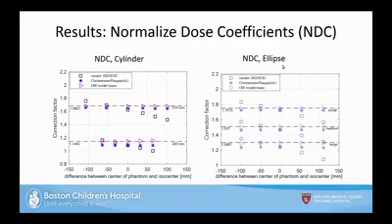It might just not be relevant for diagnostics because patients are just lying on the table. I think for us, our patients aren't necessarily lying on the table. There's like a big, thick thing between the tabletop and the patient that is variable per patient. Oh, I see. Yeah, right. But probably for diagnostics, they're just on the table.